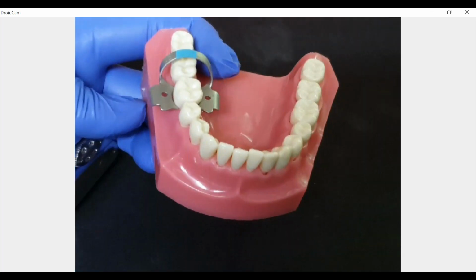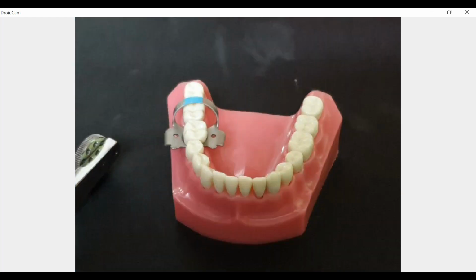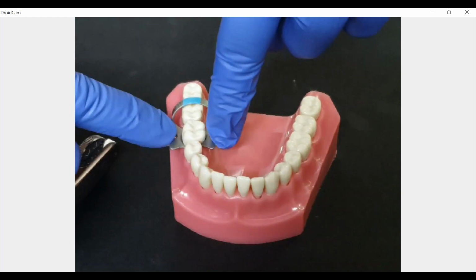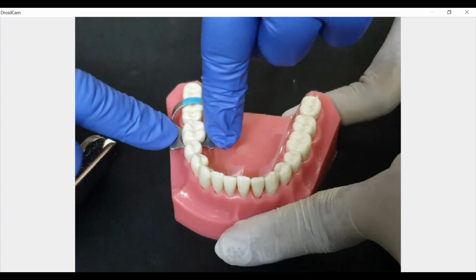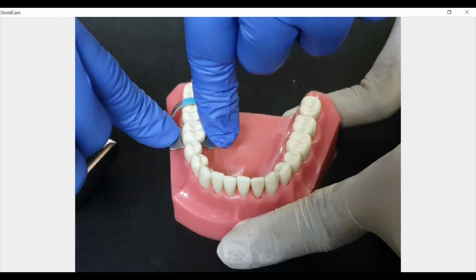Yet, when you check in the patient's mouth, what do you do? Now, this is the patient's mouth, for the sake of convenience. You will place your fingers and try to rock the isolation. If it doesn't move, it's a steady one.